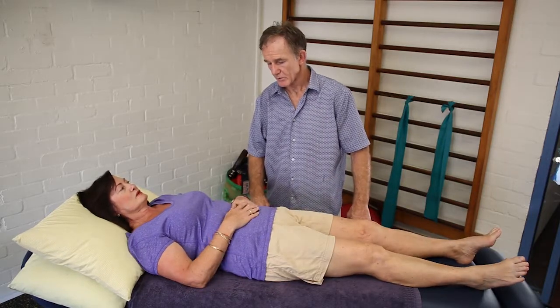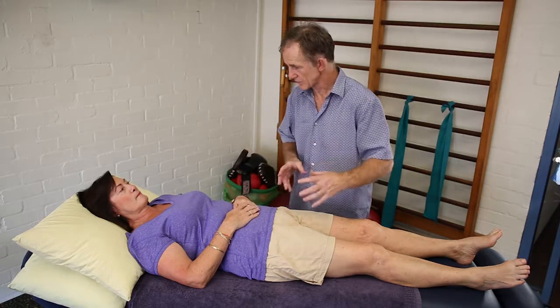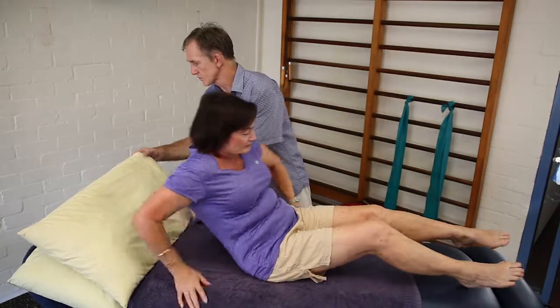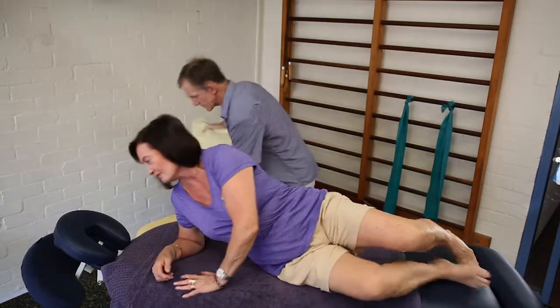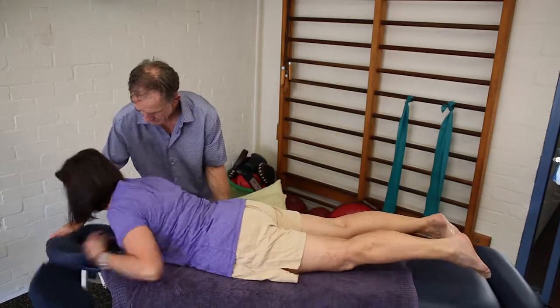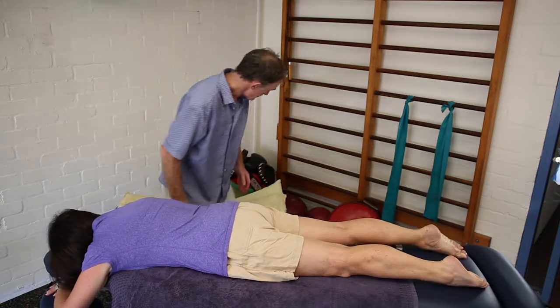And what I'd like you to do, Susan, is to roll over, and I'll just demonstrate how I use the moist heat pad from a physiotherapy perspective. Okay. I'll just roll over there, just lie down there. Just put your head there, Susan. Okay, and rest there. Now, I'll just get my pillow.